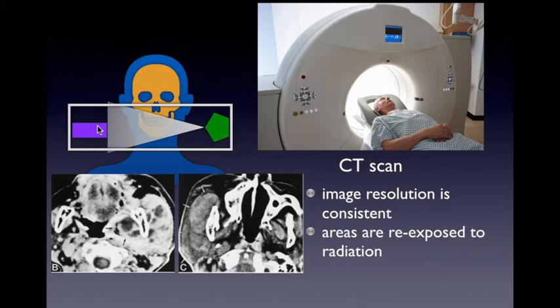This produces the consistency in CT scans because it only gets the specific X-ray every single time. It will not take anything from any other part of the X-ray. It will only detect a specific area.